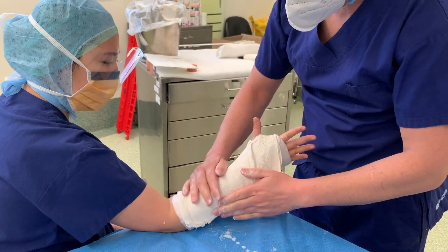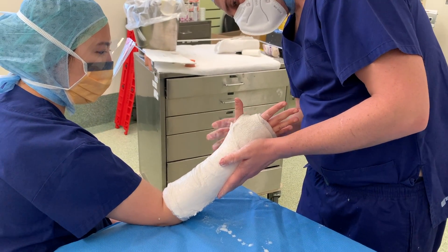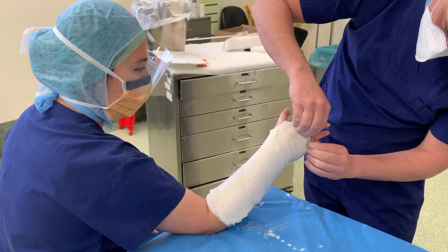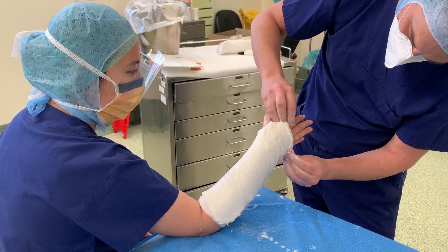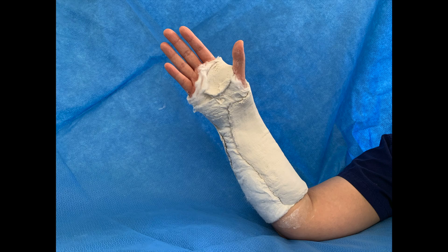We apply the plaster onto the radial and dorsal region of the patient's forearm, then smooth out the plaster and fold the excess softband back onto the plaster. It's important to ensure that the thumb has free movement and the cast is not past the MCPJ. It should also remain approximately two finger breadths below the elbow crease.